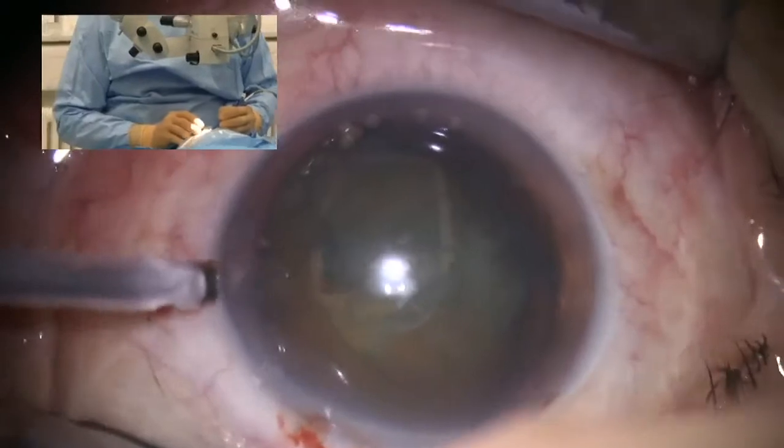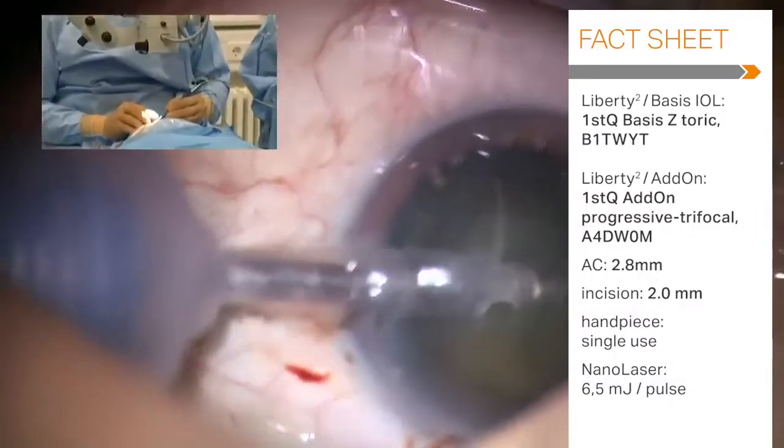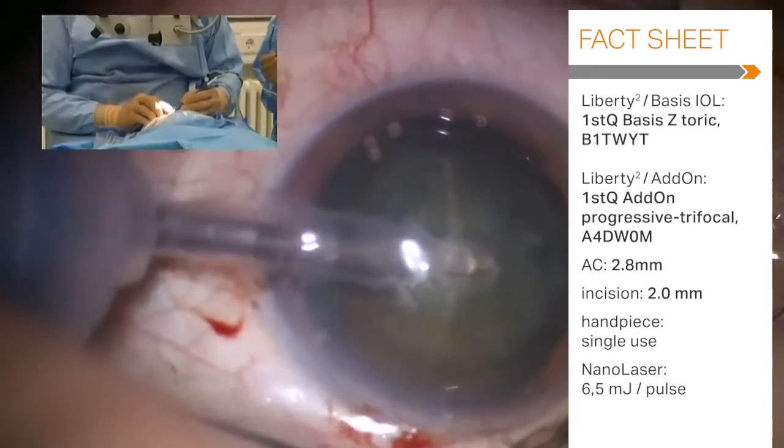You normally need, there was a question, what size of the capsulorhexis you need. I normally aim for 5 millimeter.